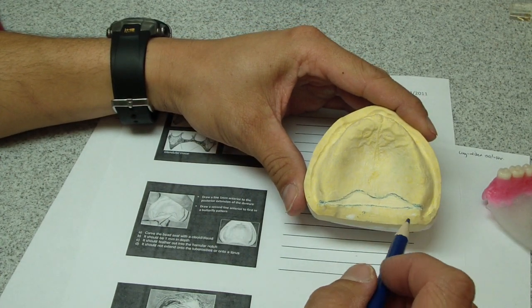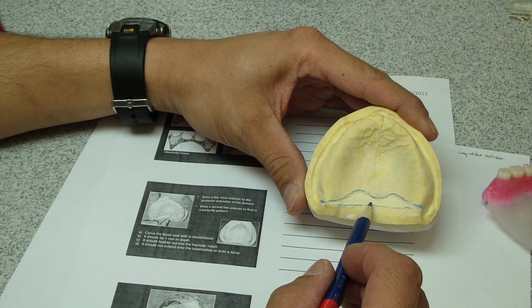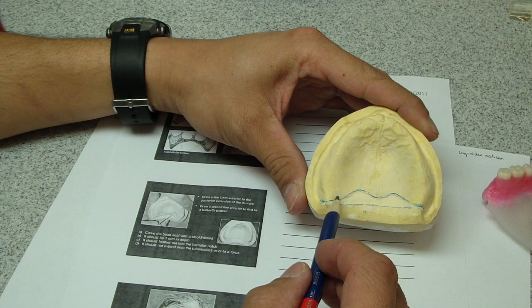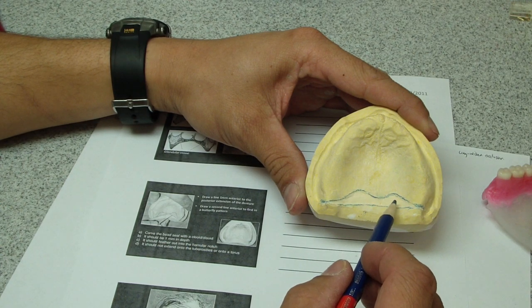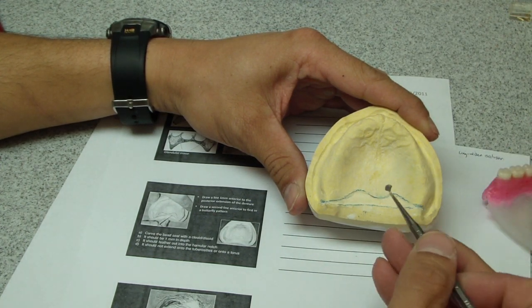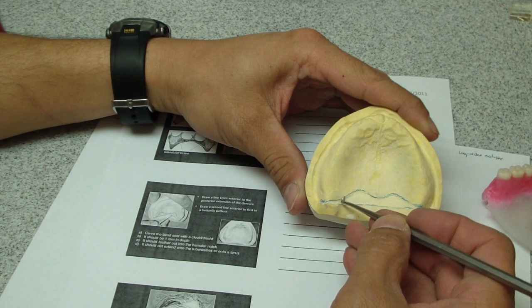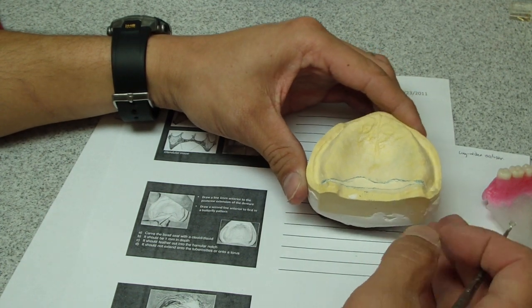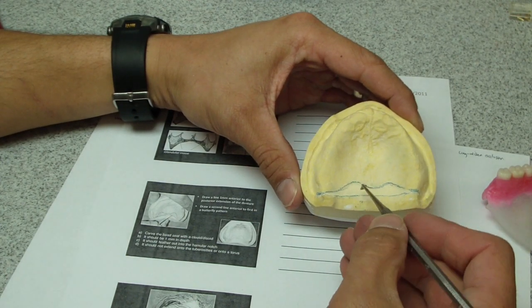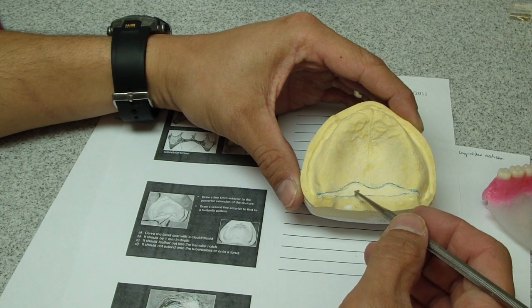Essentially it's a 1 millimeter line anterior to the posterior extension of the denture, and then the second line is in a butterfly fashion. There's not really any prescribed distance. I took my discoid cleoid, this is a fairly large one, and carved it approximately 1 millimeter deep. You can make this either not deep to deep, or deep to not deep.